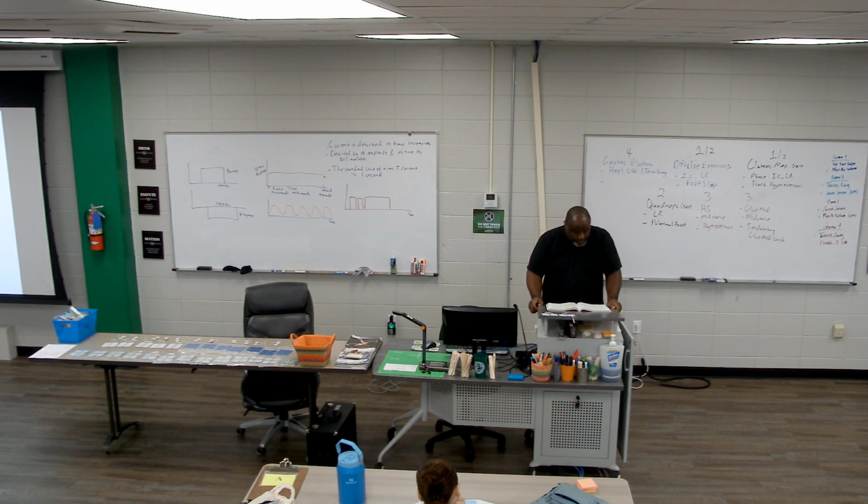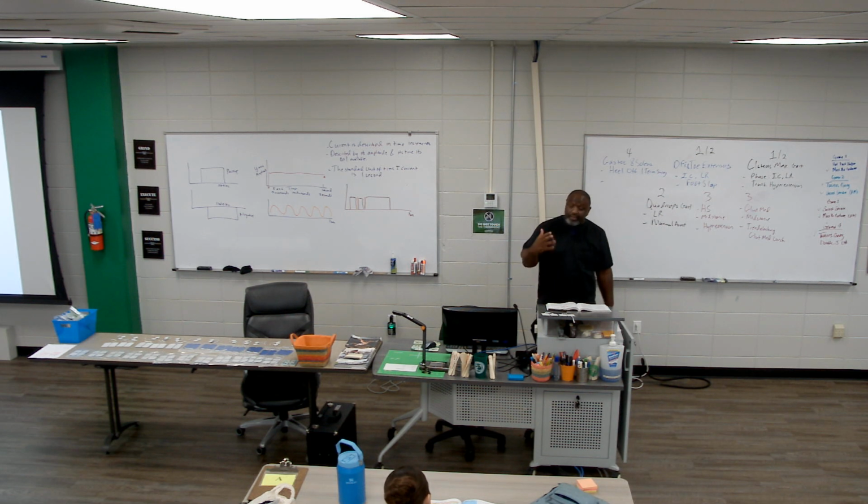Okay. So that's the thing about polyphasic. It'll just be multiple phases, but it's still going to be felt by the body as one phase. Now, let's go back to biphasic, because biphasic has different things that it can be. It doesn't just have to be biphasic. Well, let's say this: it can be biphasic with extra components.